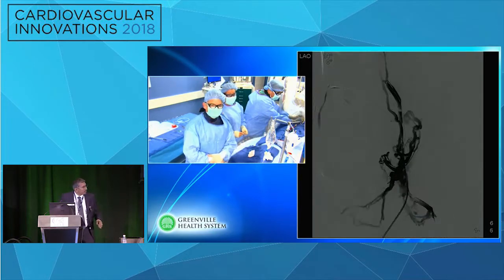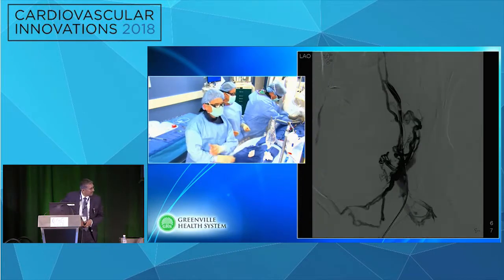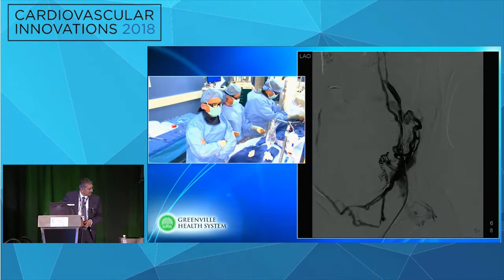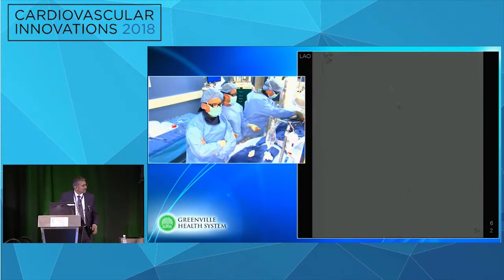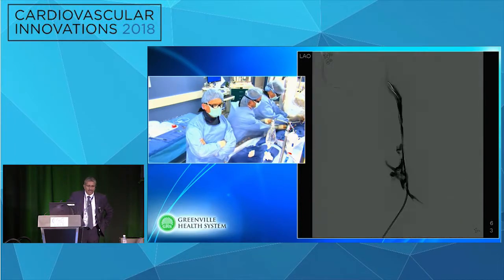So Bruce, this is a good point. Just going to ask the panel, Dr. Rosenfield, are you going to direct the sheath, pull it back down and redirect, or are you going to get a lower access? And any other opinions, please? I think what I'd do is probably, first of all, I'm not sure why you need to keep it 5. You could go up to 6 or 7 because it's venous.